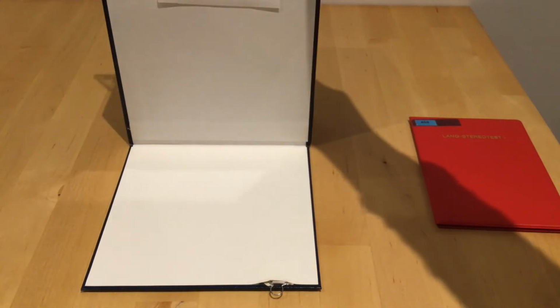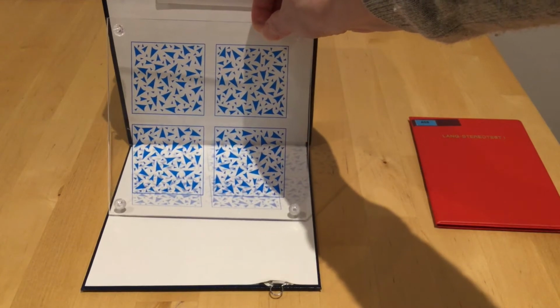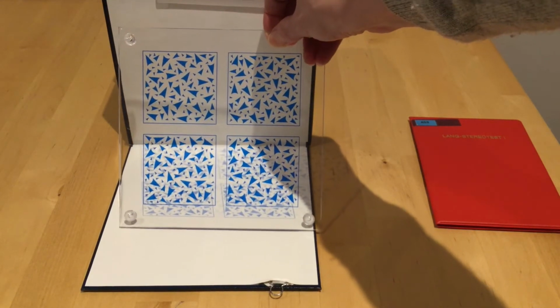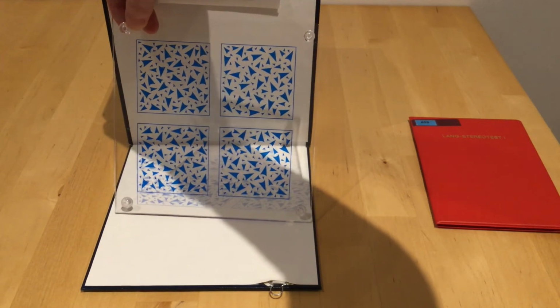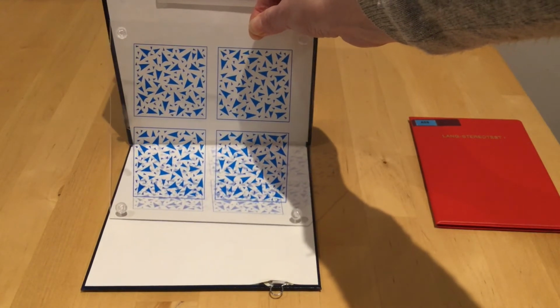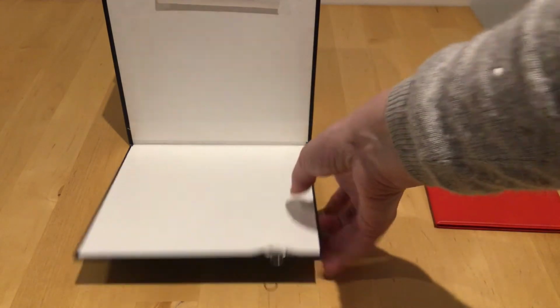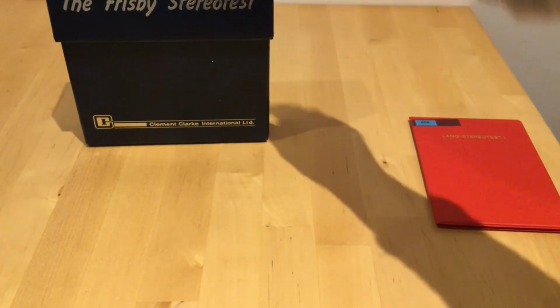So once they've done that one, you can then move on to a slightly thinner plate, and again we've got the same thing. It's a circle in the middle of the square, but because the plate is thinner, the circle is less pronounced. It's not standing out as much, or if you have it the other way around, the hole is less deep. And you can do it either way. And again, the thinnest plate, yet again, we've got a hole. It's in the top right here, but very, very slight. So that is the Frisby stereo test, made by Clement Clarke.